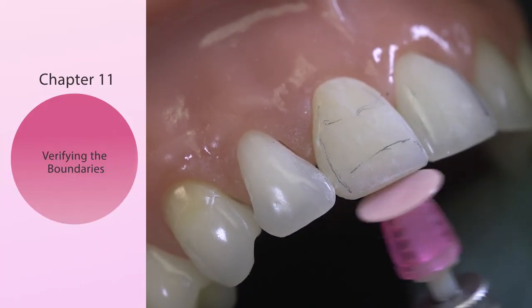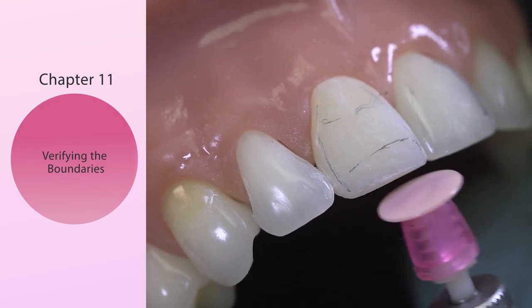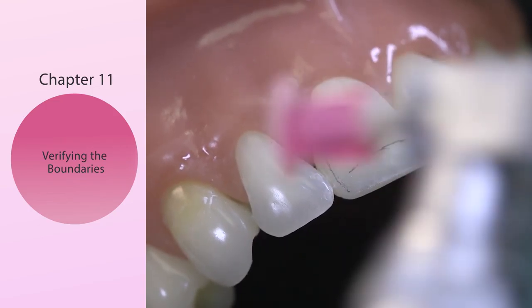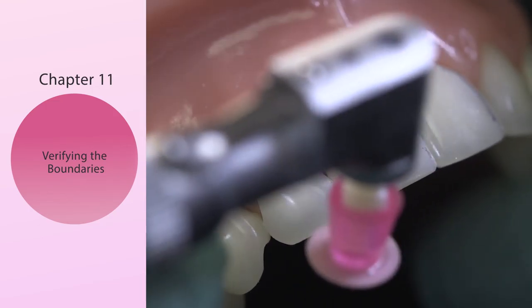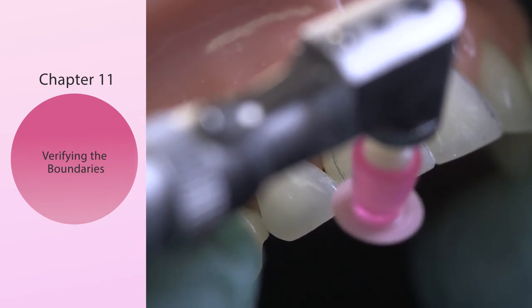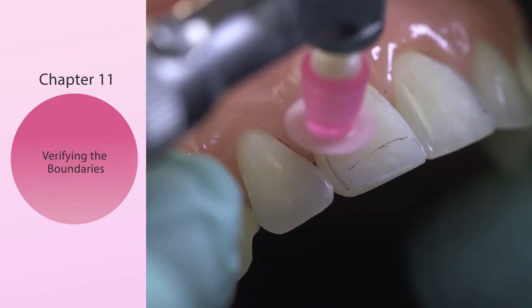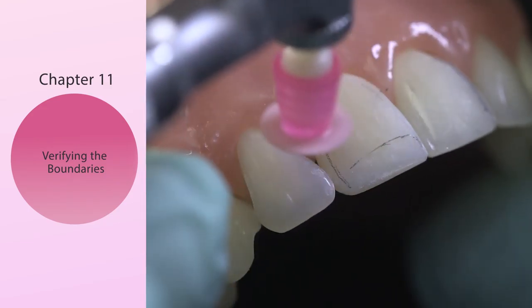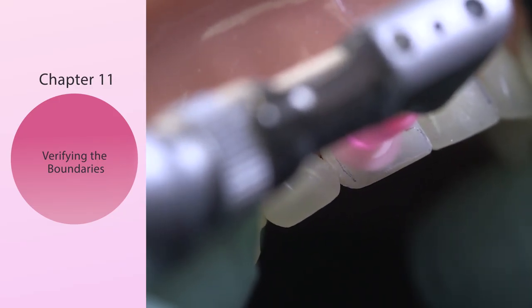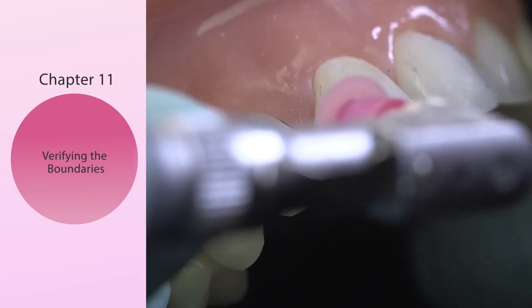Let's go into the red extreme disc. This is the one that's got the high-tech from the semiconductor industry, and it has these little channels to express the ground-up debris out the side of the disc. This is going to be at seven microns. I'm just going to go over before I go into the polishing sequence — low RPM, a very fine light dusting. You can see I'm starting to remove my pencil lines, my boundaries right now. This is really a wonderful disc. You can see by using this disc, it starts to pre-polish the tooth.